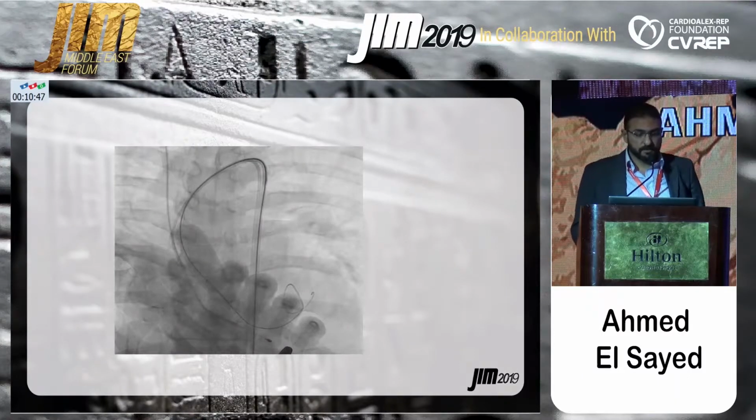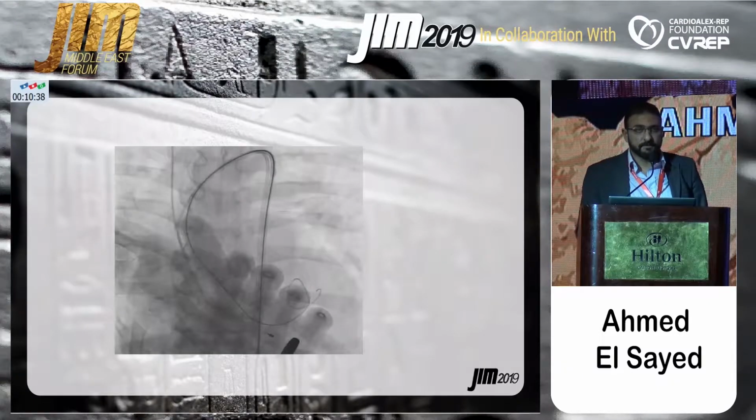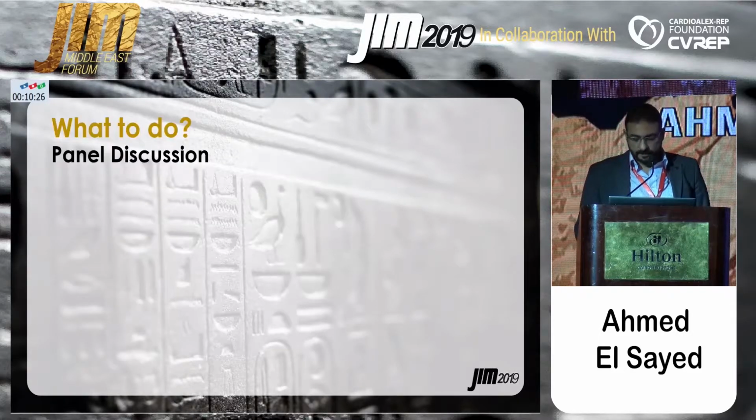Even before inflating the balloon, the patient arrested with ventricular fibrillation. We started resuscitating the patient, and while they were doing the resuscitation, I went with the balloon aortic valvuloplasty to improve the hemodynamics. After a single DC shock and 2 minutes of resuscitation, the patient was back.